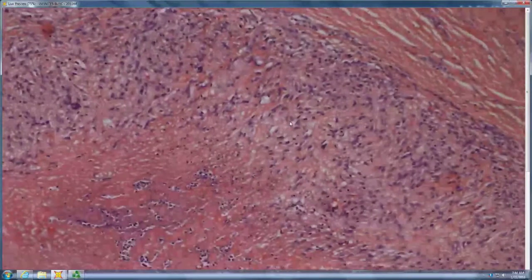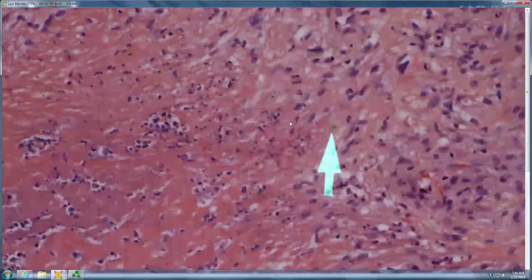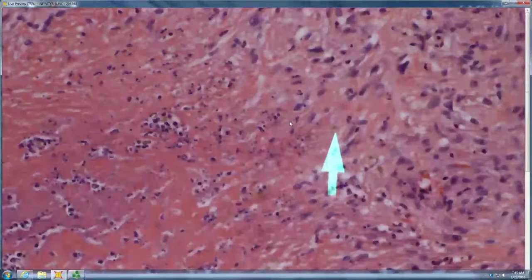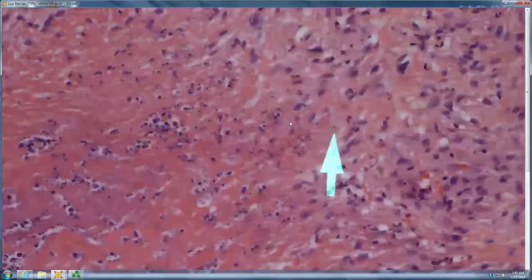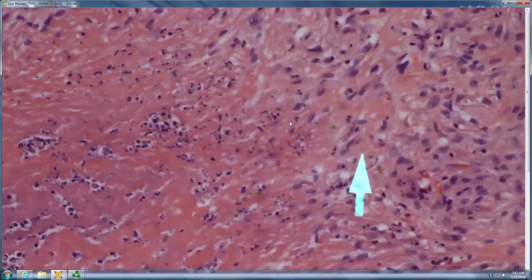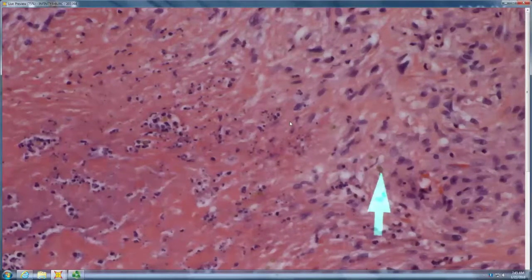It's like granular, with a pigment. It looks like phaeohyphomycosis. So phaeohyphomycosis if hyphal, and if just round little spores, it could be chromomycosis. Chromo, and you can see the fission of the spore right there where it's dividing.